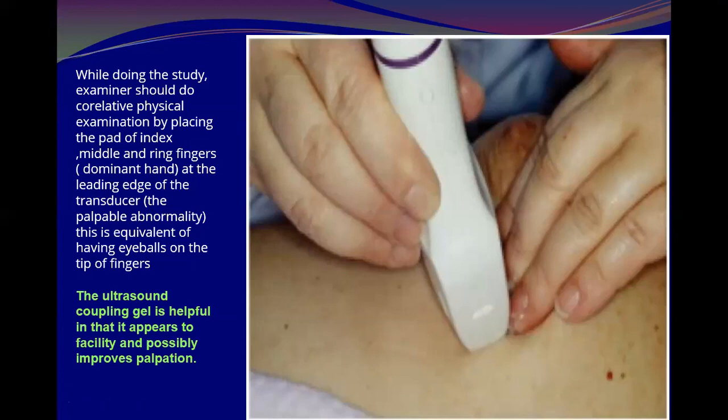They describe it as being equivalent to having an eyeball on the tip of the fingers.